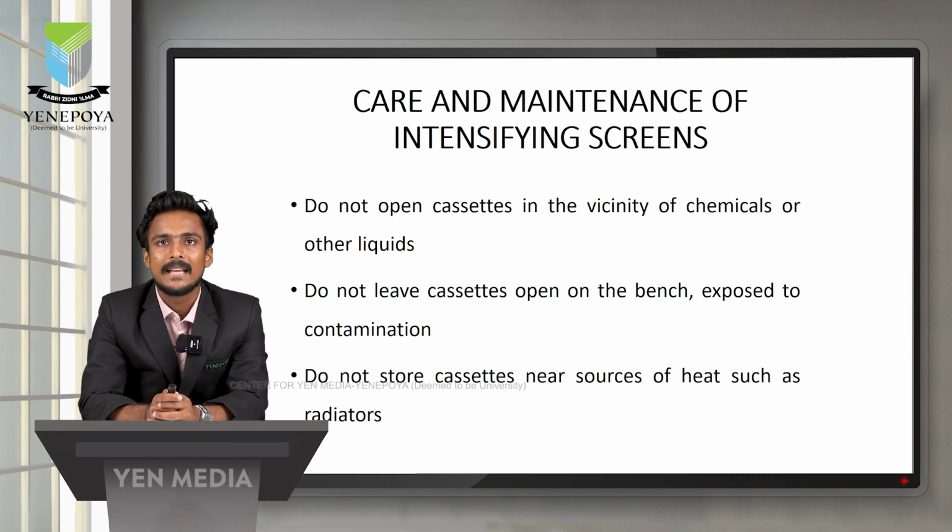Moving to care and maintenance of the intensifying screen. First, do not open the cassette in the vicinity of chemicals or other liquids. Second, do not leave the cassette open on the bench exposed to contamination. Third, do not store the cassette near a source of heat such as radiators.